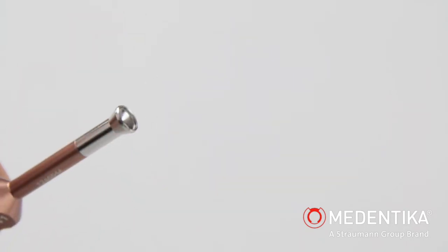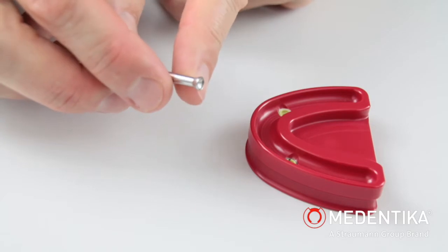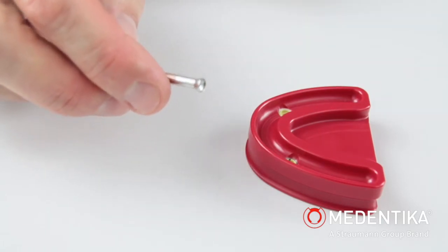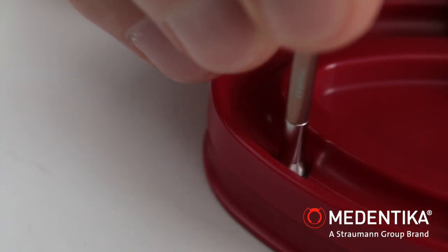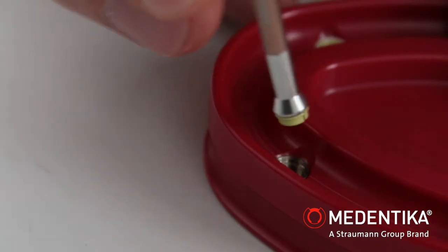In reverse, we use the funnel-shaped tip to remove the retention insert again from the matrix housing. The instrument is also guided in a perpendicular direction here until the insert perceptibly engages.